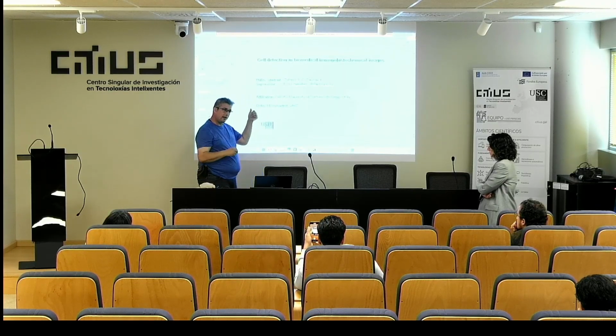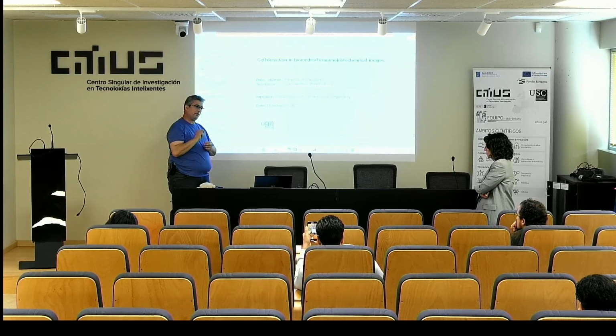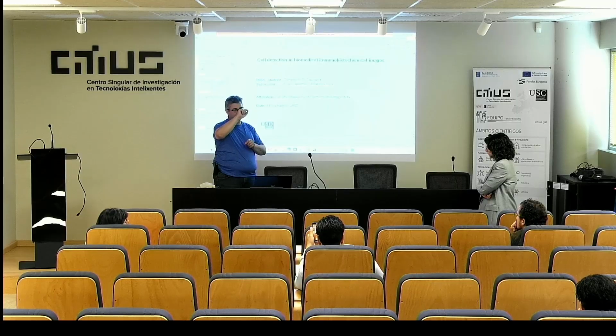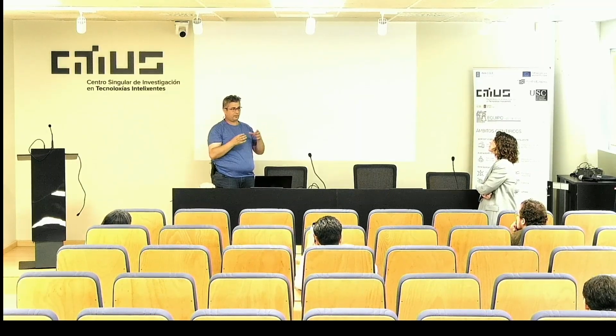So there's a confidence score, for example in YOLO, on whether there's a cell or not. We don't care about drawing the circle and finding the shape of the circle, because there's sometimes overlap, because the shapes of cells are too different.